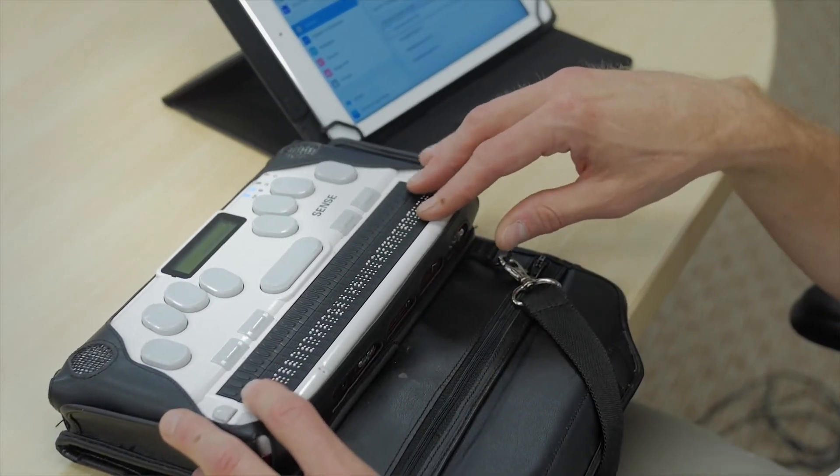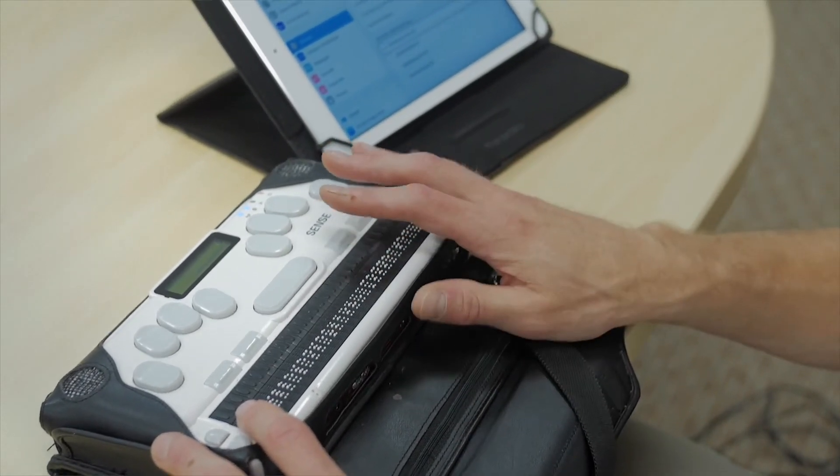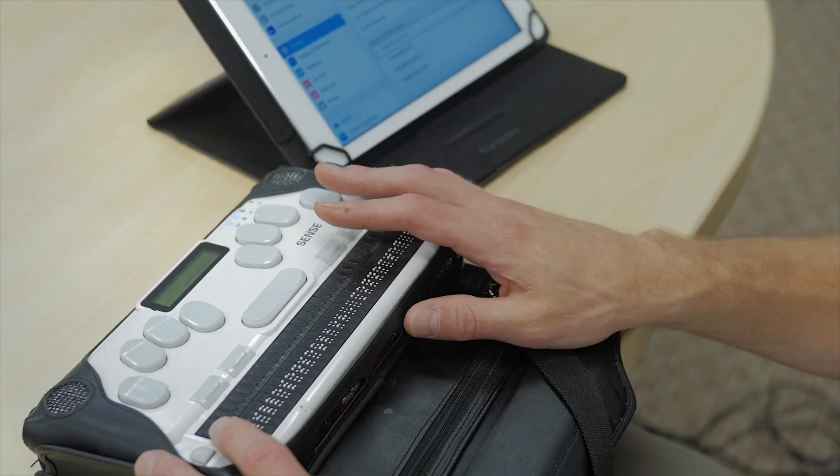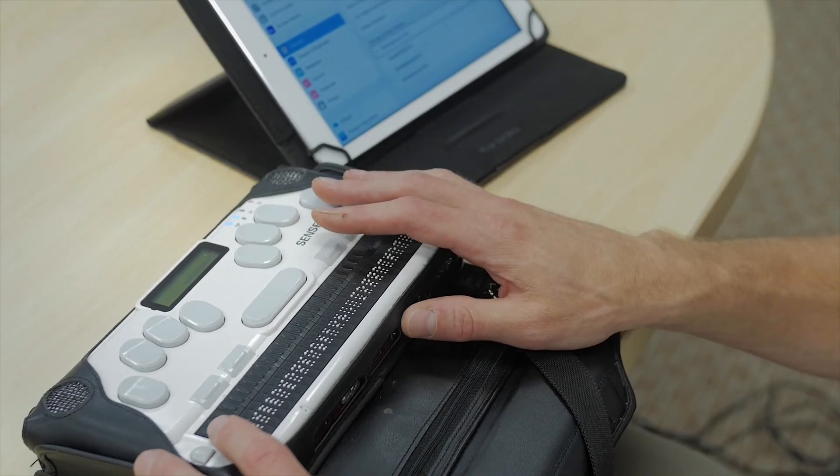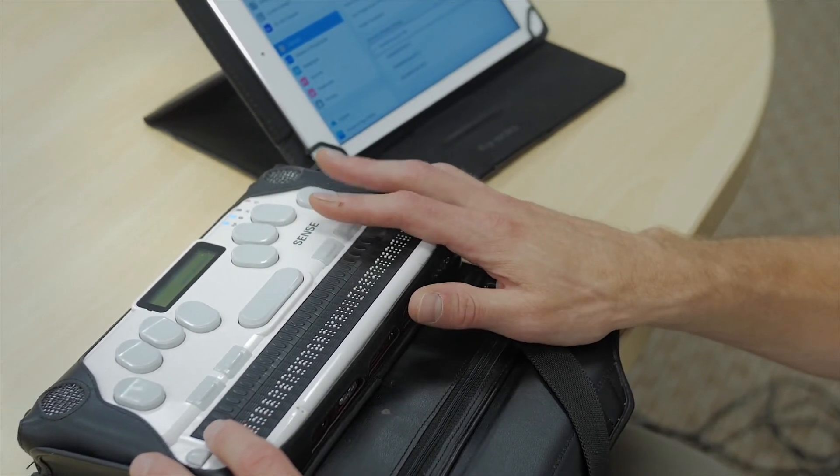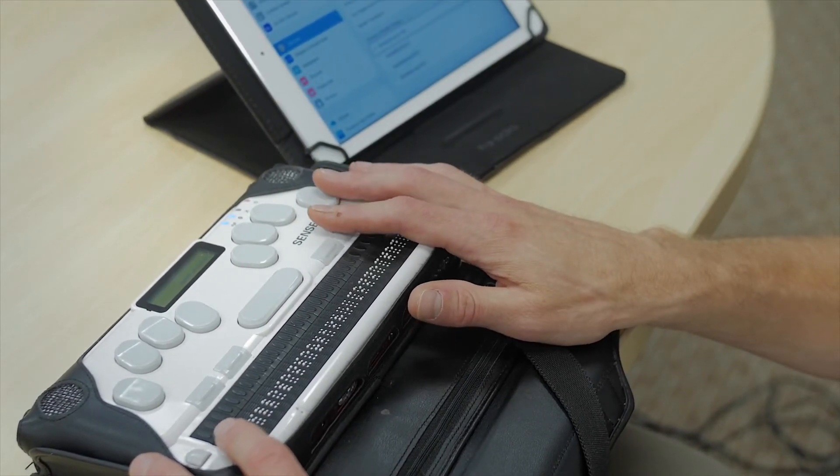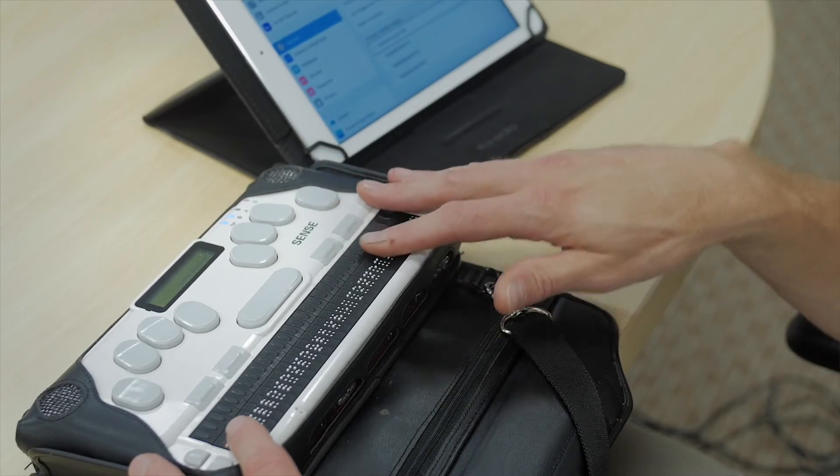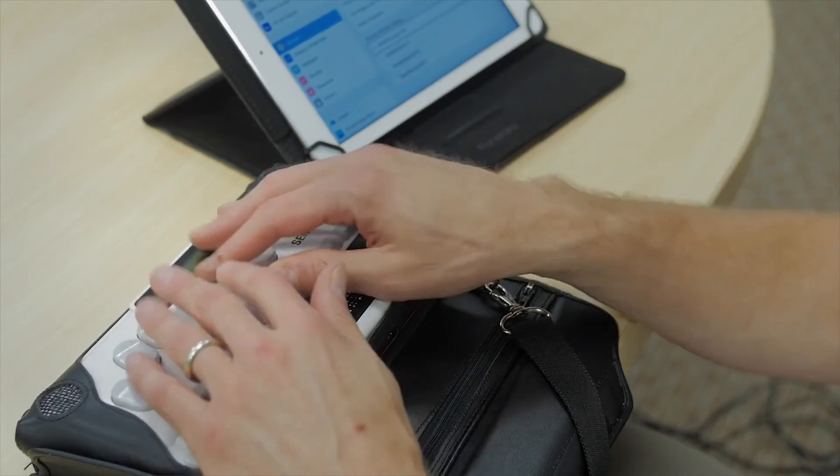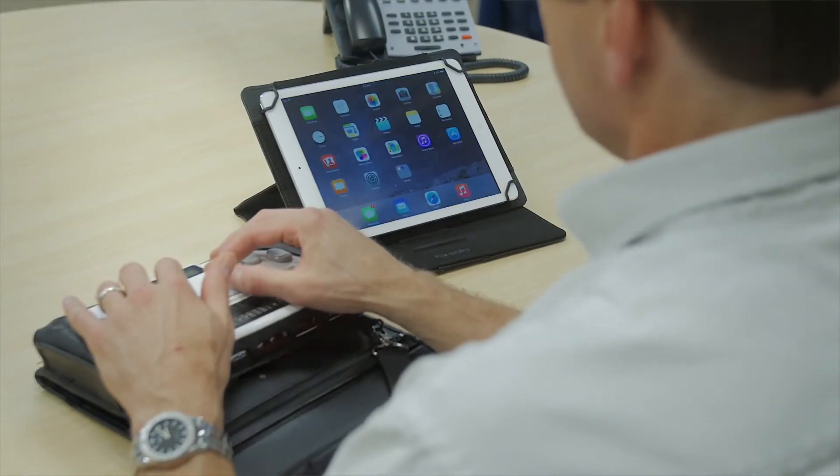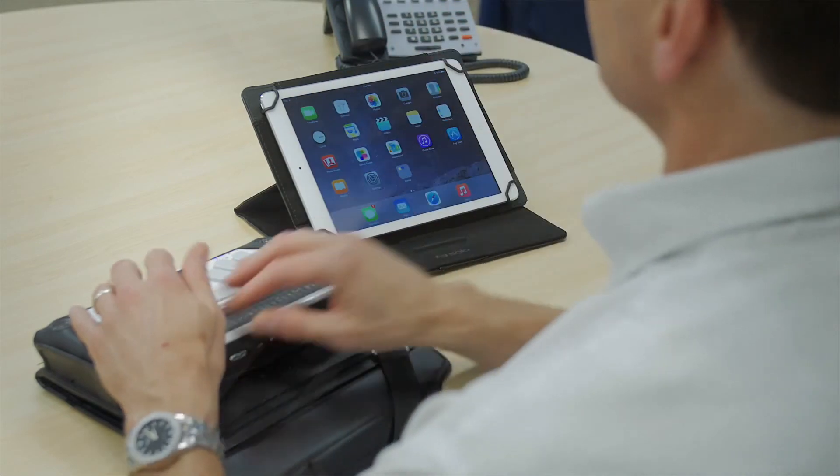If you were asked for a PIN from the BrailleSense side, you would enter 0000 in Nemeth Braille and follow it with enter or dropped numbers. And we have control of our iPad.